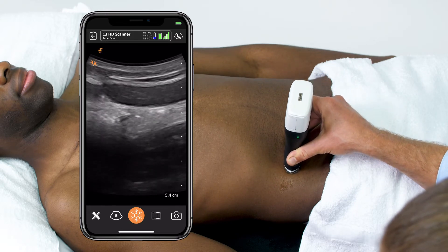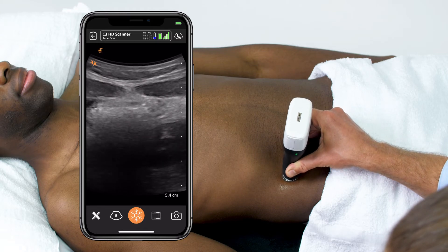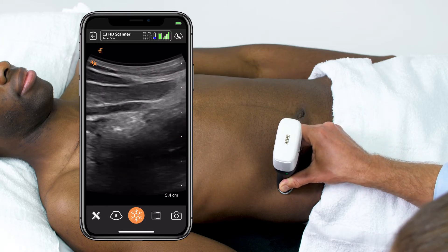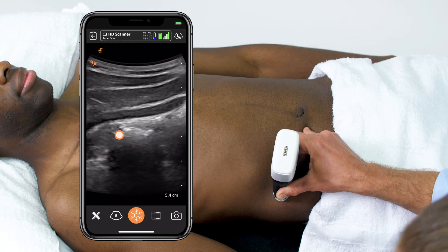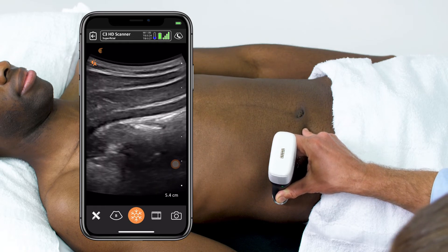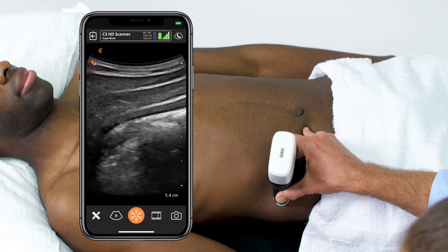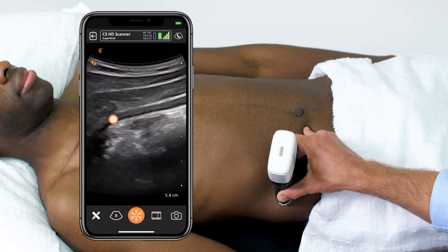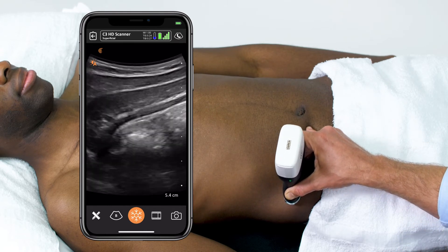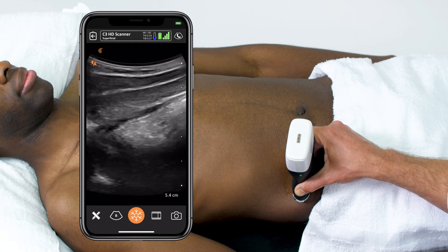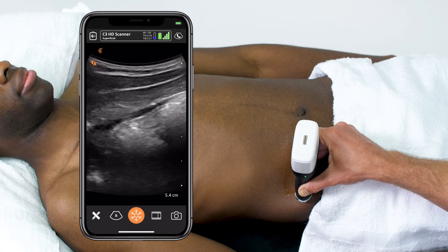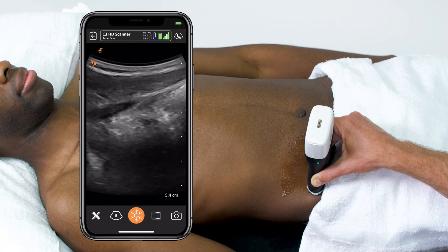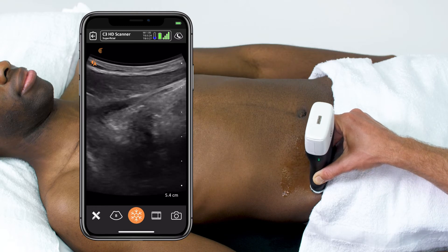I'm going to apply some gentle pressure, and I'm going to slide that transducer off to the patient's right until I find the so-called dirty shadowing of the colon. Above and superficial, I can see the abdominal wall musculature. I'm going to slide the transducer down towards the patient's feet until that dirty shadowing ends, signifying I've reached the level of the cecum.